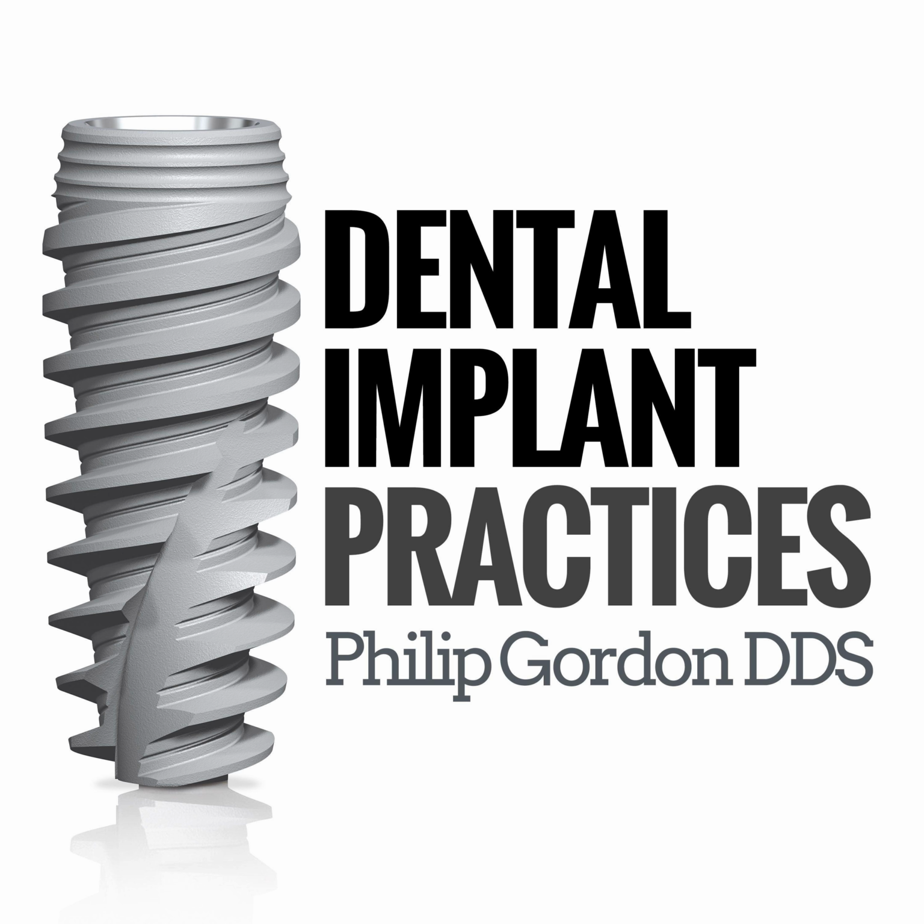There are scanning abutments for each of these implants. A lot of people are going digital now, so you can get scanning abutments. And then there are various analogs to send to the lab too. So there are lots of things to think about when getting the implants, and what type of system, and how you're going to heal and how you're going to impress.